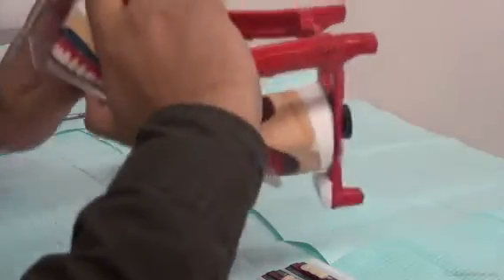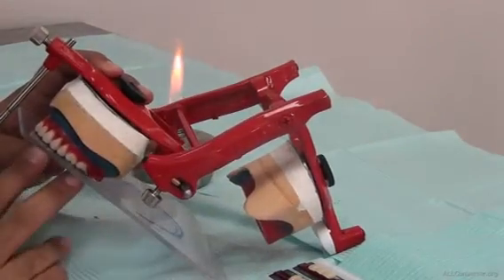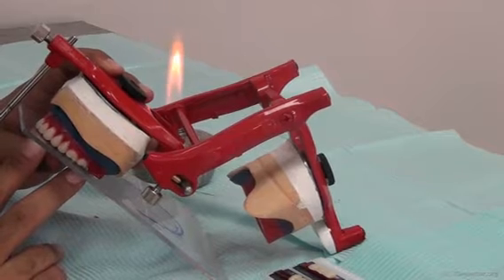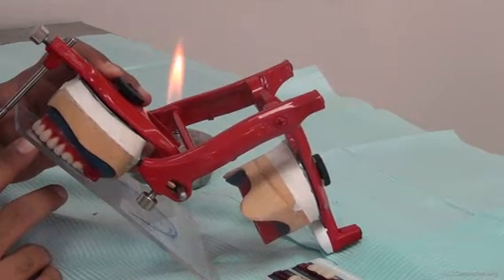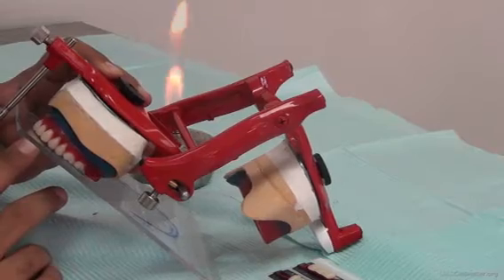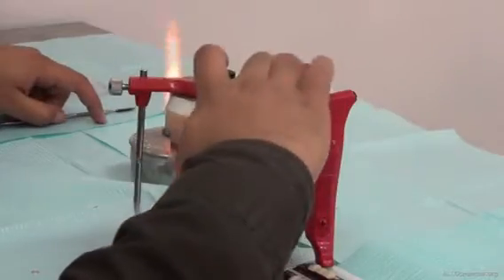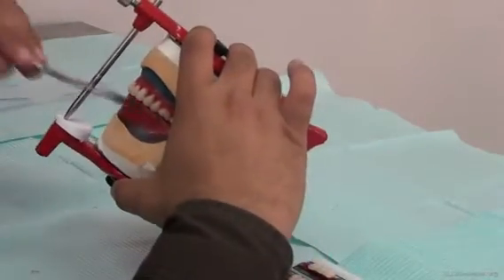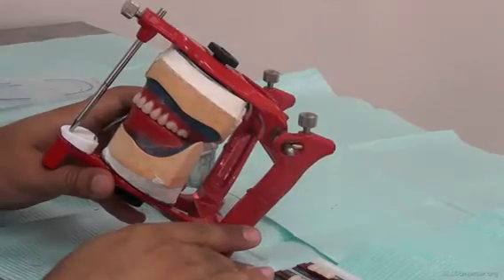So in terms of which cusp is touching, which is not, the angulation of the roots, and angulation of long axis of teeth, curve of Spee, curve of Wilson, all of these features that have been present in the upper, we recheck them according to the previous video that you have seen. And then we put the teeth back, and we make sure that the relations we have seen on the glass slab are also present in the wax.